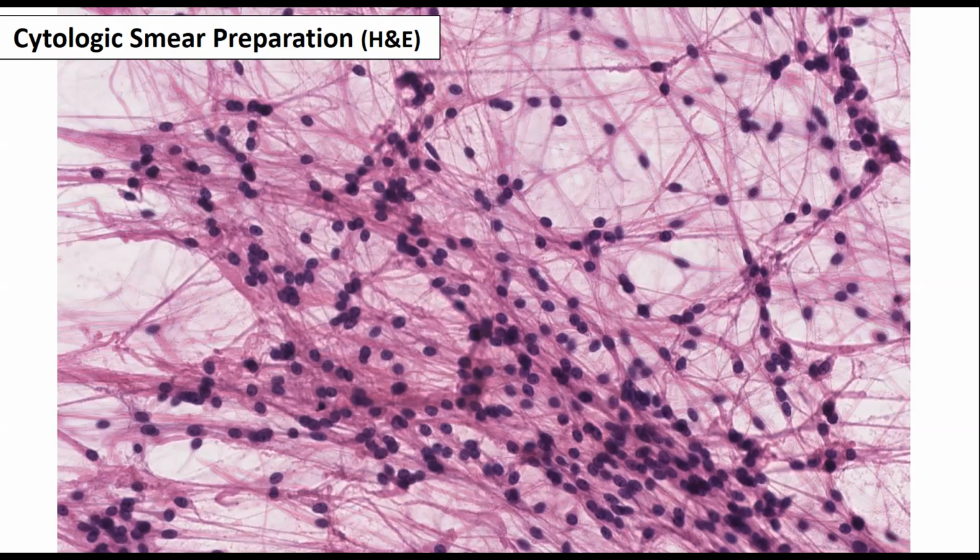Or what's the fourth pattern? I'm sorry, I'm gonna have to make it 5. If it's in the spinal cord, intramedullary in the spinal cord, you would have said it is a well circumscribed mass in the center on cross sections in the center of the spinal cord, surrounded by a rim of viable cord, probably with a syrinx, or let's call it a space above and below. Or here's the 5th pattern. I should have said 5 patterns.